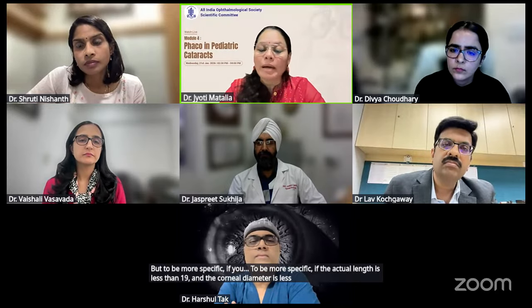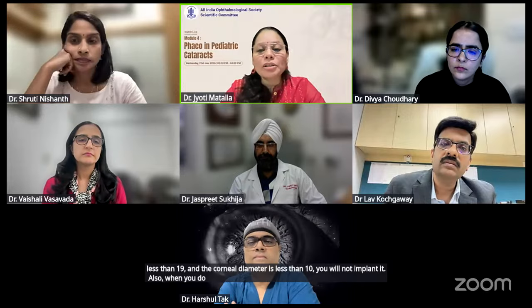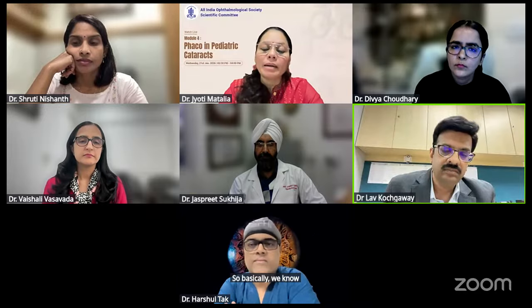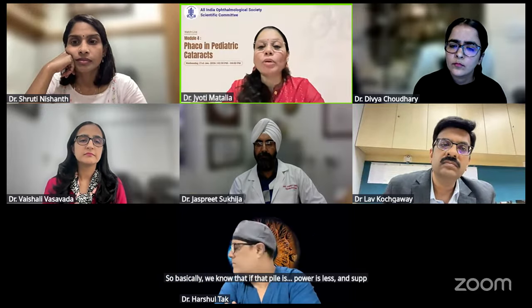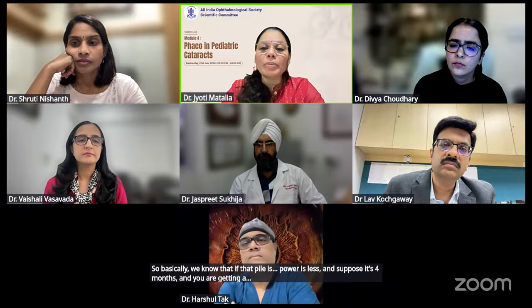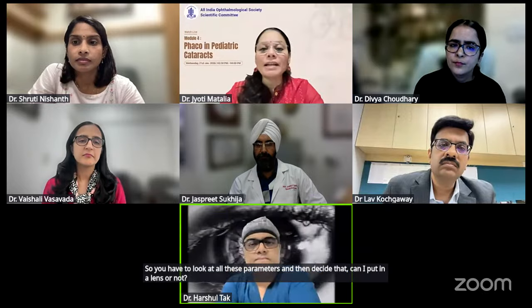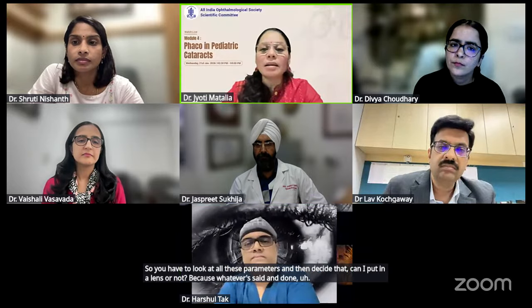To be more specific, if the axial length is less than 19 and the corneal diameter is less than 10, you will not implant it. Also, when you do an IOL calculation, we do not get lenses more than 30. Suppose it's 4 months and the IOL calculation comes to about 40, and you're going to do so much undercorrection, you should know that you are eventually going to give him a refractive error, because you're going to balance him assuming that his refractive error is going to be best at 18. So you have to look at all these parameters and then decide whether you can put in a lens or not.